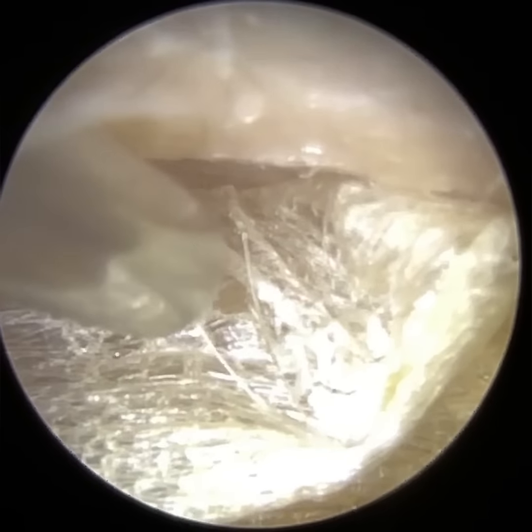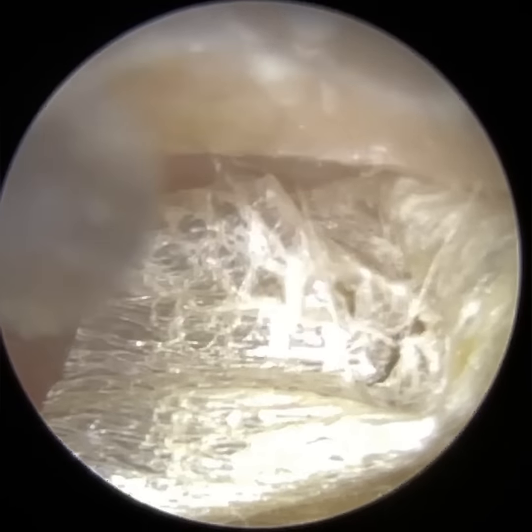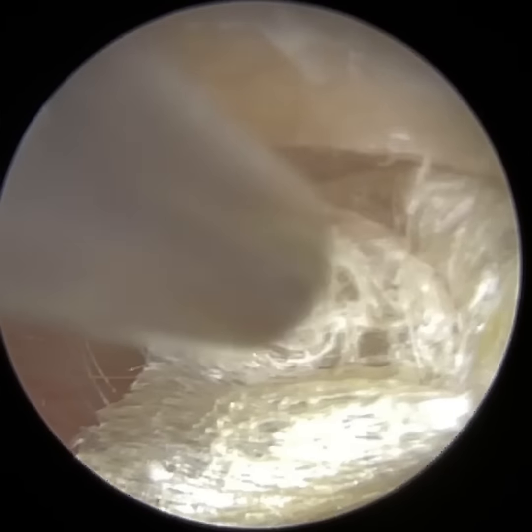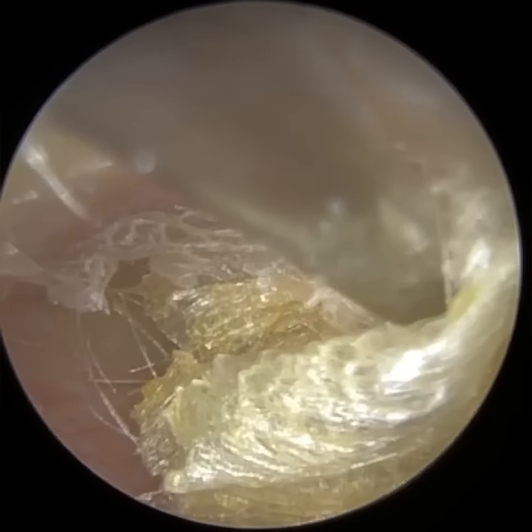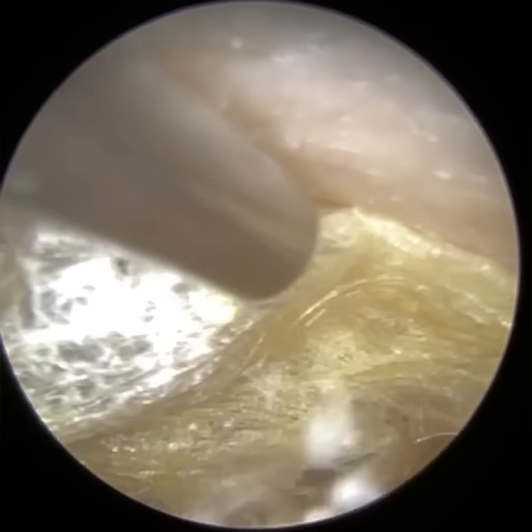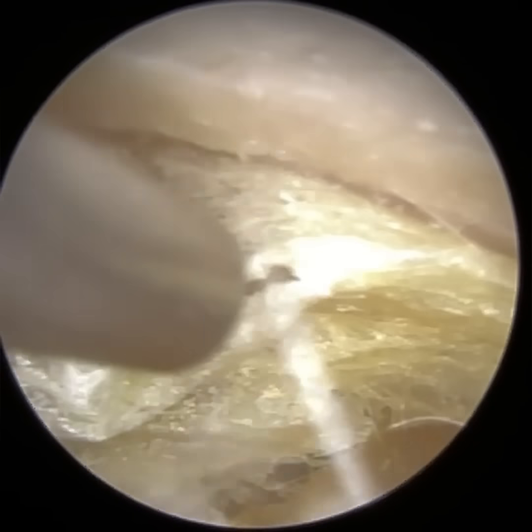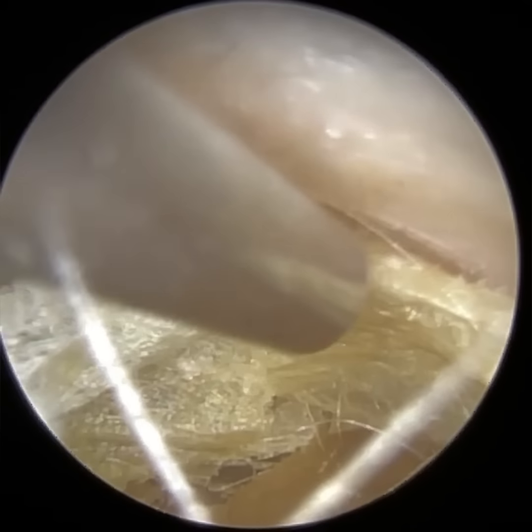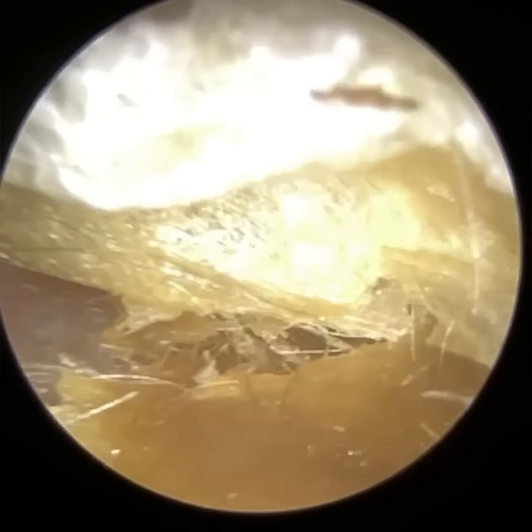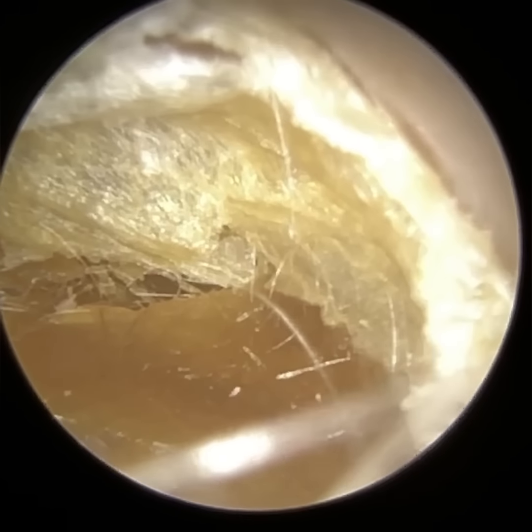if you push the bones forwards, so the stapes bone is pushing into the oval window, you should then get a ballooning outwards of the round window, because as you're pushing in through the oval window, fluid is being forced into the cochlea, and as a result, the round window itself balloons out because the fluid is being pushed all the way through and bulging up against the round window. So it's a technique that I've seen some surgeons use.